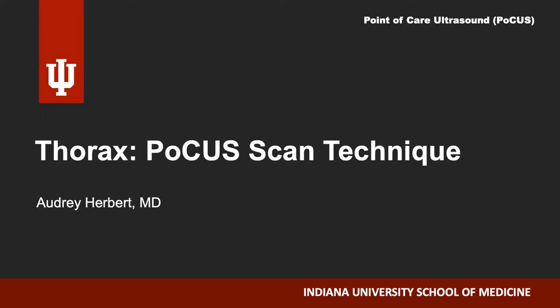Hi, I'm Audrey Herbert. In this section, we'll be reviewing the point-of-care scanning technique for imaging the thorax.